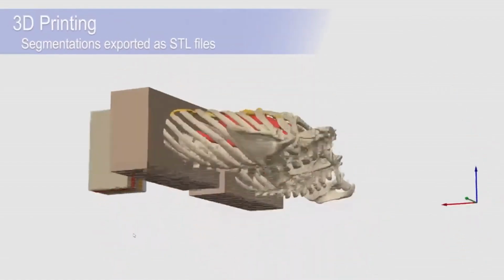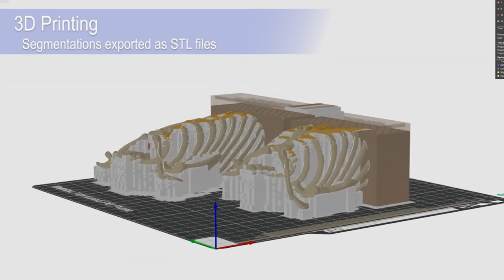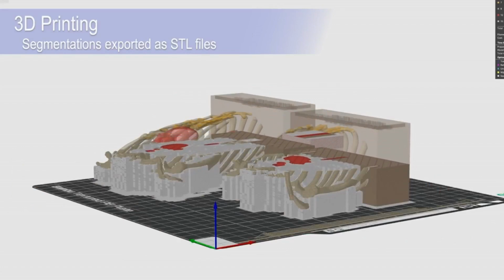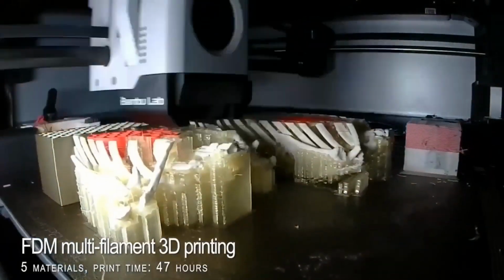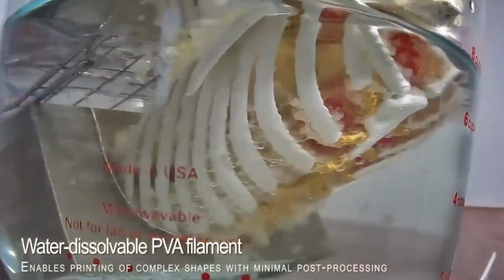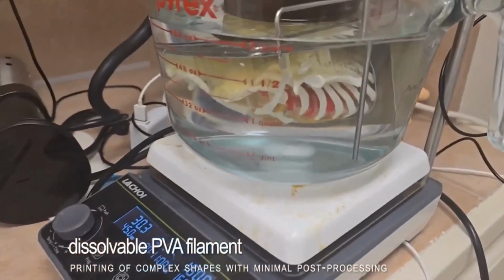One of the interesting things you can do with segmentations is export them directly from the 3D Slicer program as STL files, which can then be used for 3D printing. And newer consumer-grade printers can print complex shapes using a variety of materials. And with dissolvable support materials, you can limit the amount of post-processing or cleanup work that you have to do after printing.